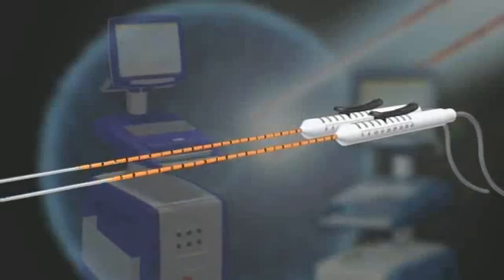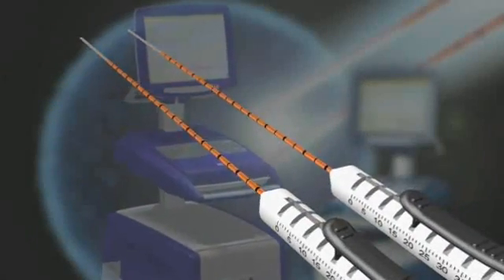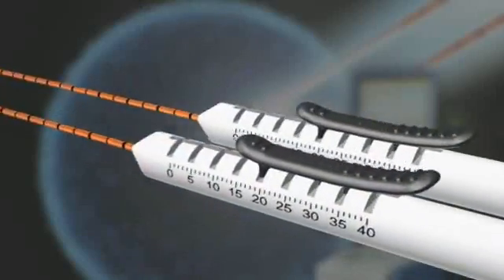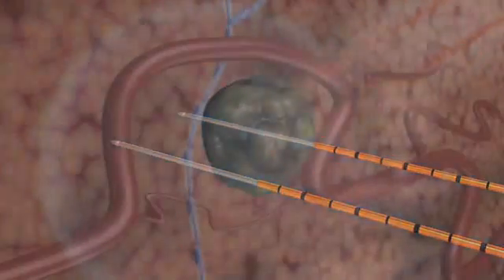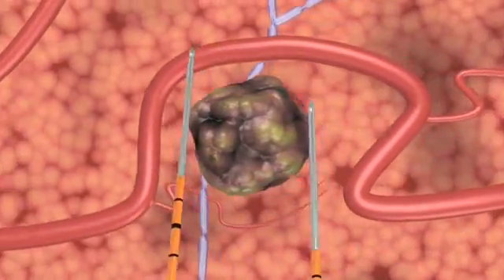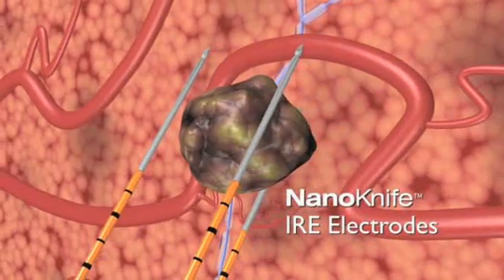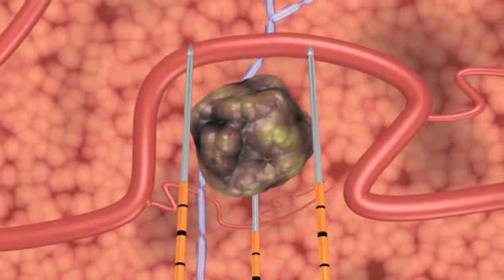The NanoKnife IRE surgical ablation system is the first to use irreversible electroporation, also known as IRE, to treat soft tissue lesions. Two or more NanoKnife IRE disposable electrodes are positioned in or around the lesion, and an electrical field is created between them in a series of microsecond pulses, which induces cell death in the encompassed soft tissue.